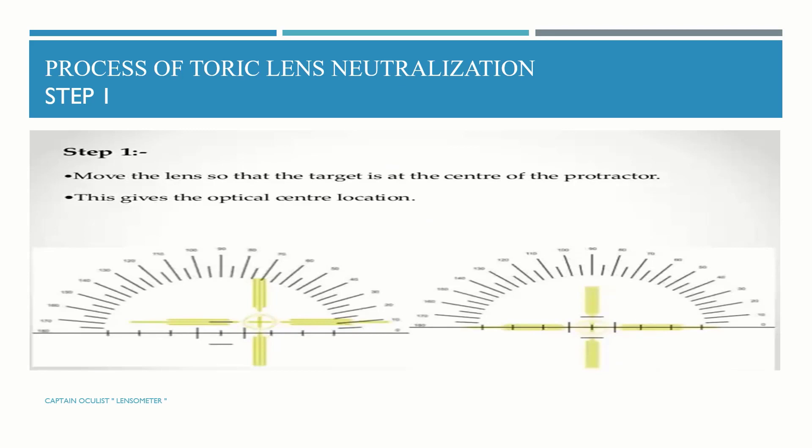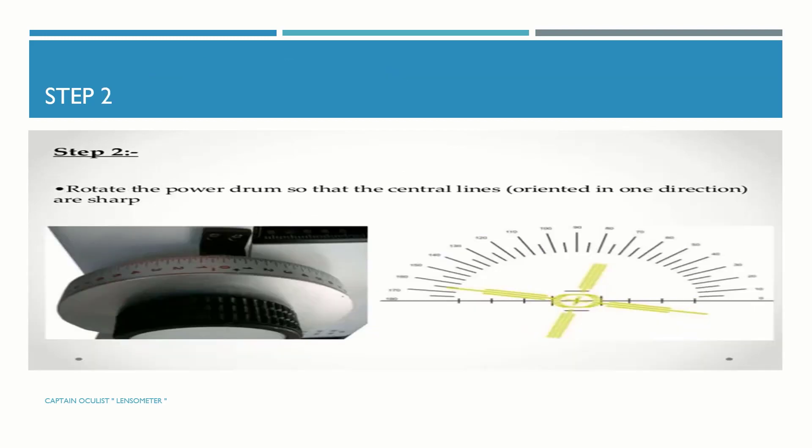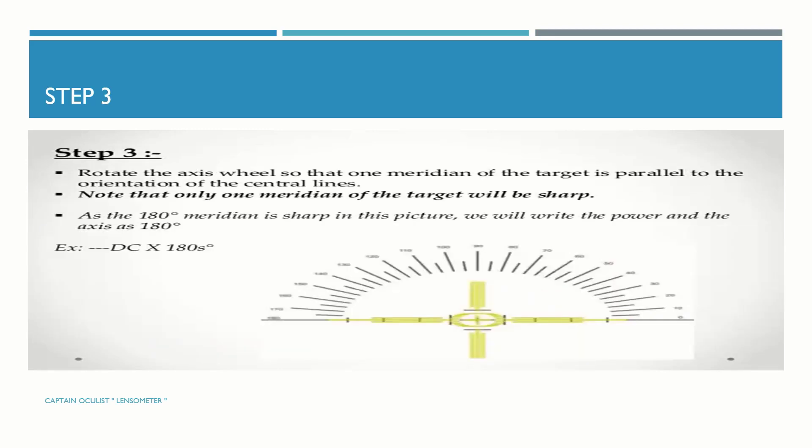The process of toric lens neutralization. Step 1: move the lens so that the target is at the center of the protractor — this gives the optical center location. Step 2: rotate the power drum so that the central line orientation in one direction is sharp. Step 3: rotate the axis wheel so that one meridian of the target is parallel to the orientation of the central lines.